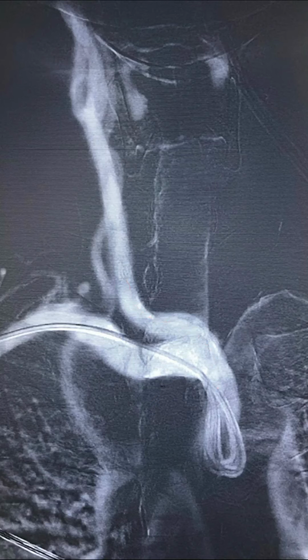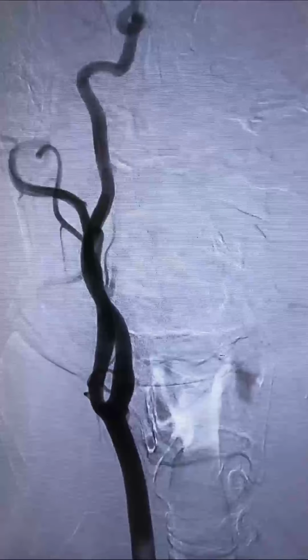So what is this white image? Road map. Always remember that. Always work under a road map image, which is much easier. You are not blindly taking your catheter anywhere. So you know that the catheter is going into the vessel which you want to take the catheter into. And what is this?